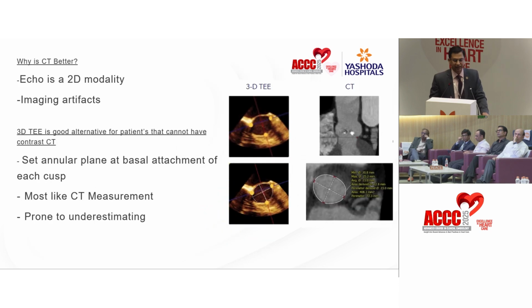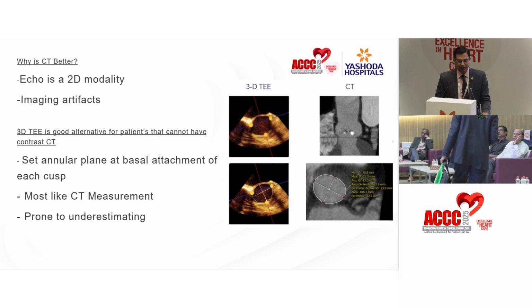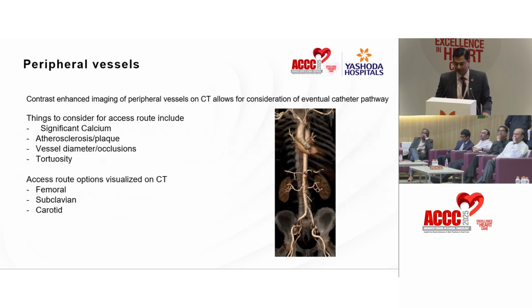And as I said, alternatively you can use a 3D TEE, but yes, there is a chance of underestimating the valve dimensions. So wherever possible, prepare your patient for a good CT and get it done.